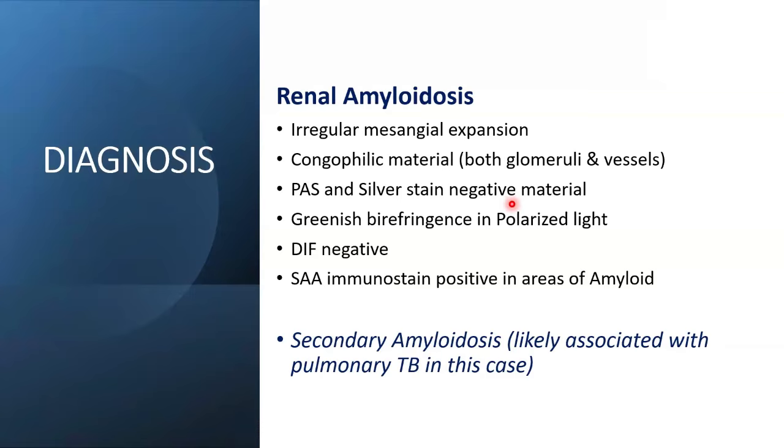But Dr. Alok, yeah, not any single IHC marker is so sensitive and specific. Mhm.